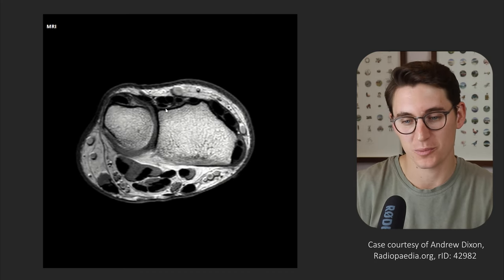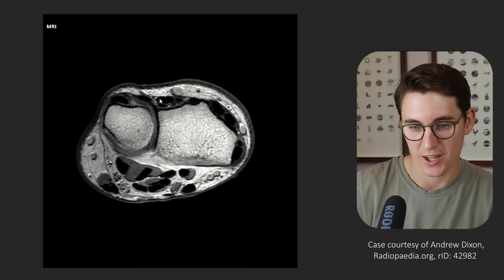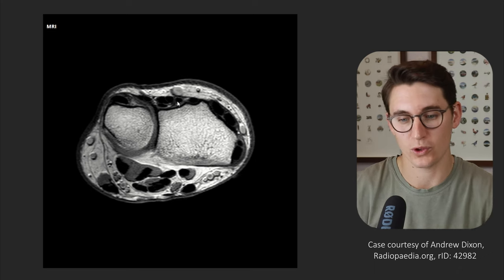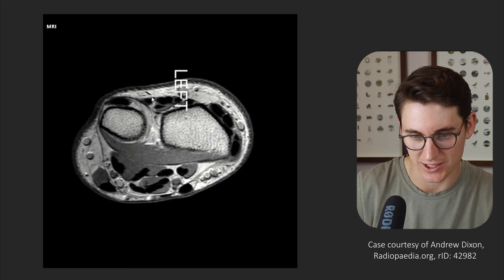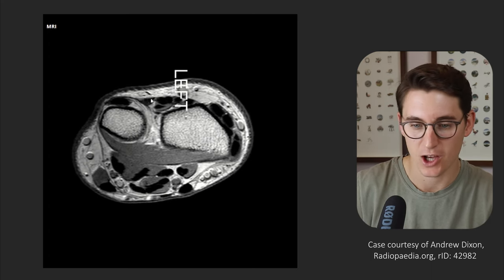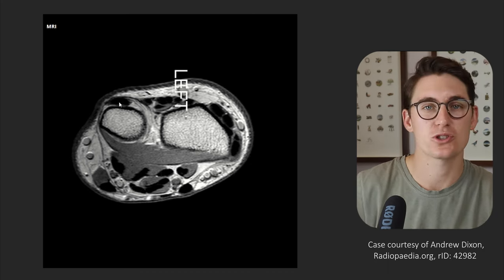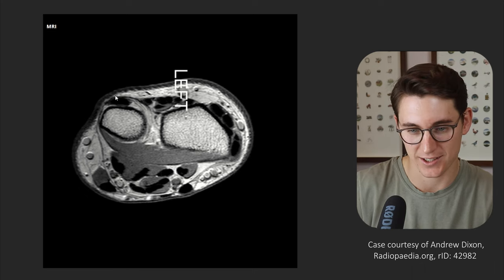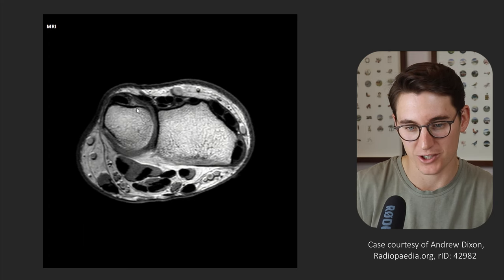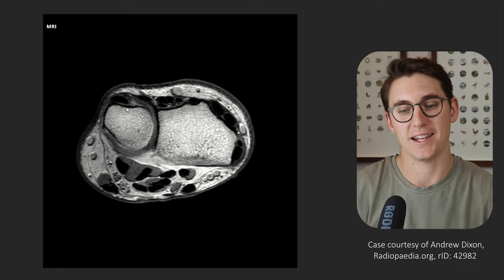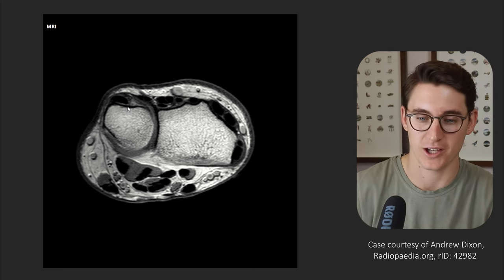Moving to our fourth compartment: these are our extensor digitorum tendons — both extensor digitorum indicis and the extensor digitorum tendons heading to all four digits. Lateral to that is our extensor digiti minimi, making up our fifth compartment. The last compartment, our sixth, has only one tendon — our extensor carpi ulnaris tendon, which runs in the ulnar groove and actually makes up the posterior surface of our triangular fibrocartilage complex, which we'll look at later.